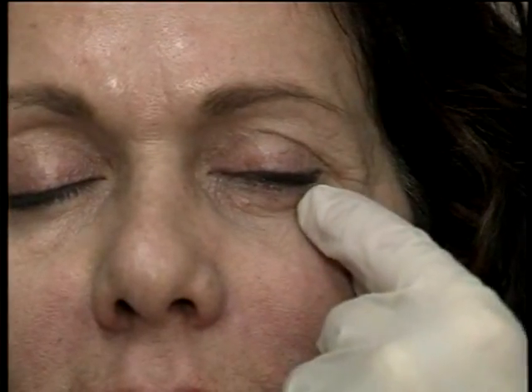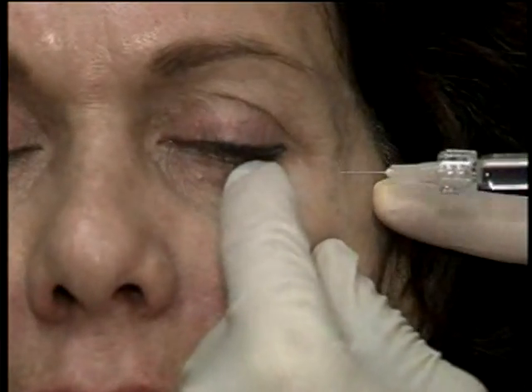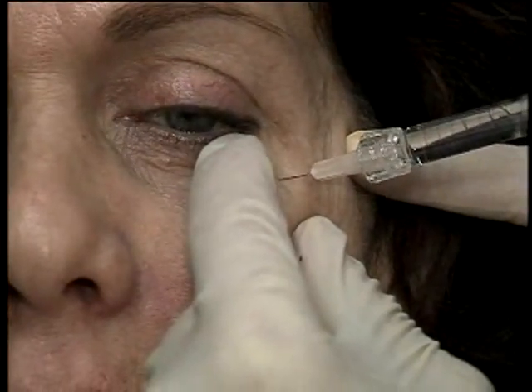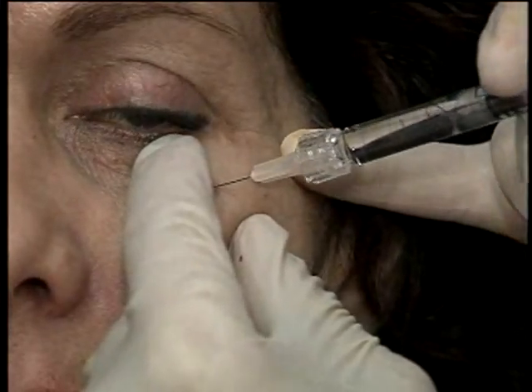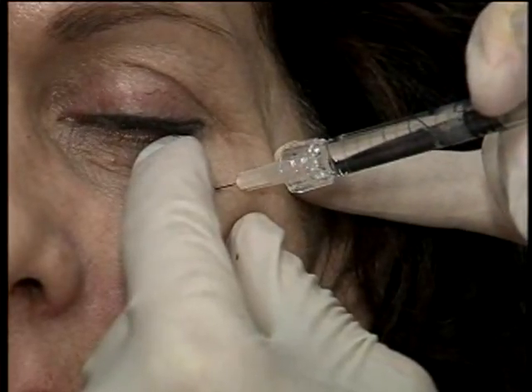Once again, I like to place it deep. I think superficial, which is favored by some, is appropriate, but it's very difficult to do well, and you're at risk for getting blue blebs. So this is the infraorbital hollow. I keep my finger on the orbital rim, so I know where I'm at all times. I'm protecting the orbit. It's kind of hard to see there, but I'm going to place my needle down onto the bone. So I'm down on the bone, I feel the bone, and I deposit just a little bit. And then I move along. Deposit just a little bit.